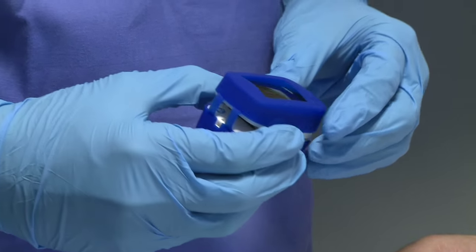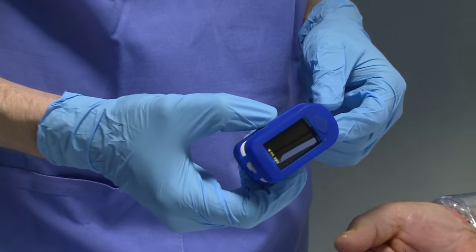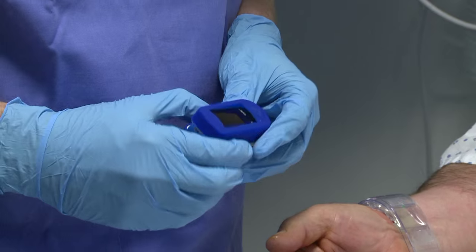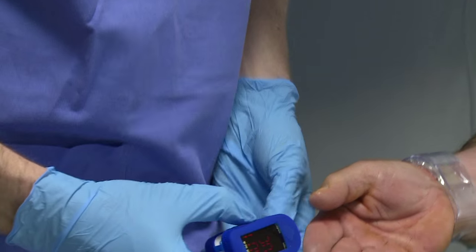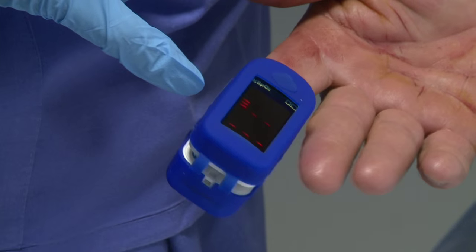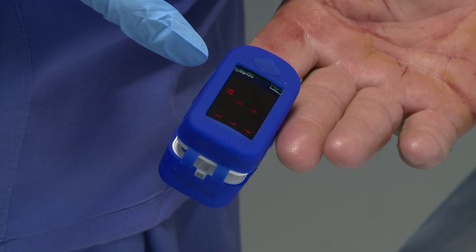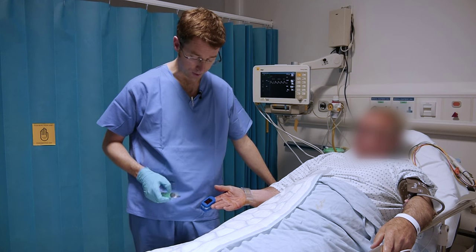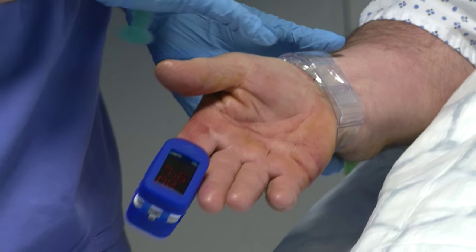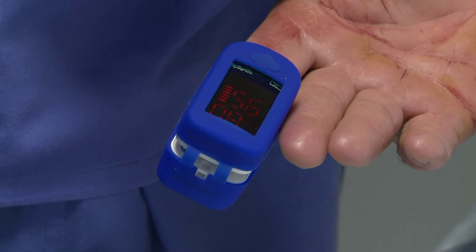To achieve patent haemostasis we need to be using an oxygen saturation probe. We have either a mobile device available or a probe as part of a blood pressure console. We'll place the saturation probe on the patient's finger. This doesn't have a waveform but it does have an equaliser-type display that allows us to see the pulsatile nature. We can see here, having inflated to 11 mils of air within the TR band, that we have no evidence of bleeding at the site of the TR band, but we still have a nice pulsatile flow, which is most likely through the ulnar circulation.